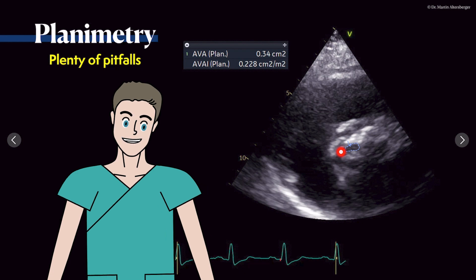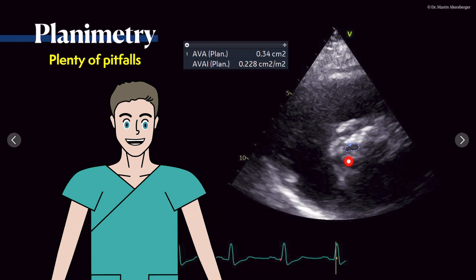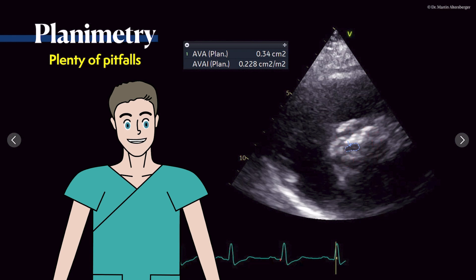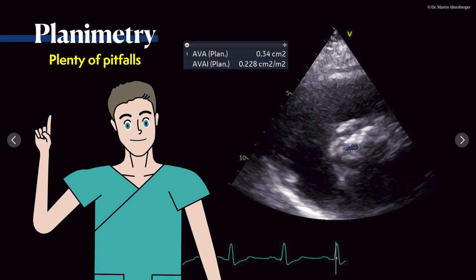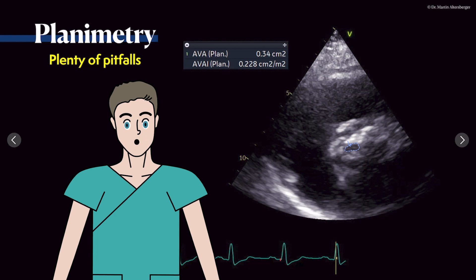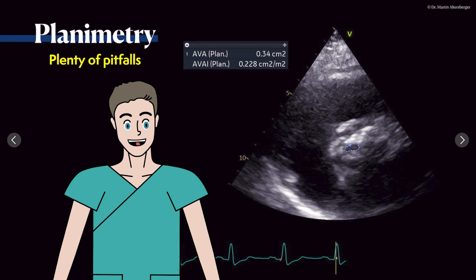Furthermore, you never know if you are truly at the smallest area you actually want to measure, or if you're in the correct plane. Very often the image quality in severely calcified valves is simply reduced. In my view, planimetry gives additional information and can help you get a feel for the valve opening, but be aware it is not mentioned in the guidelines because it simply has plenty of pitfalls.